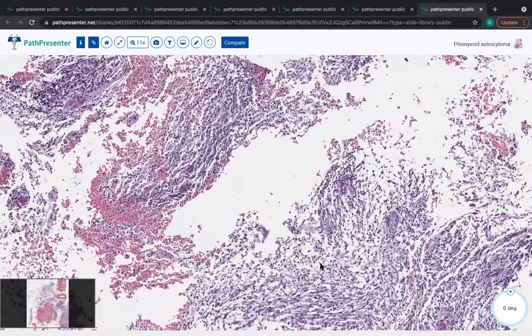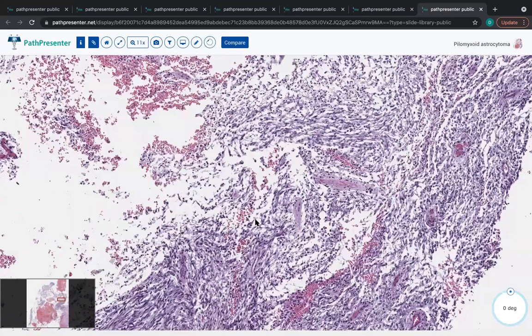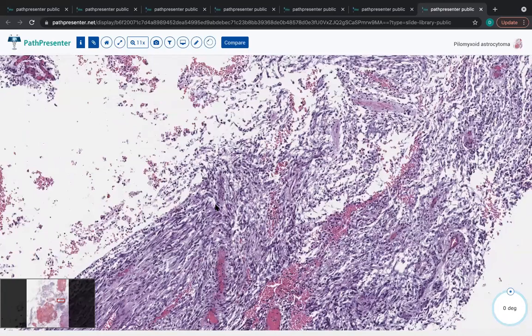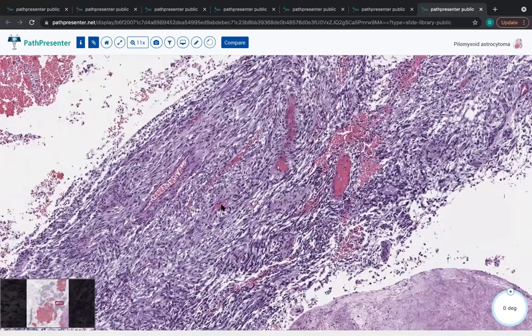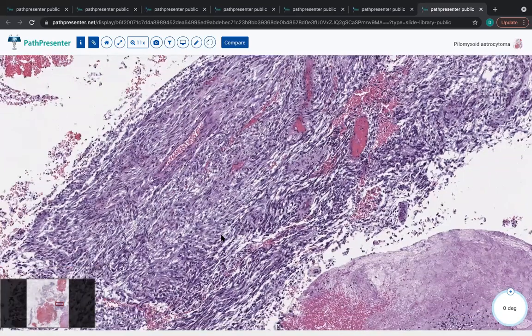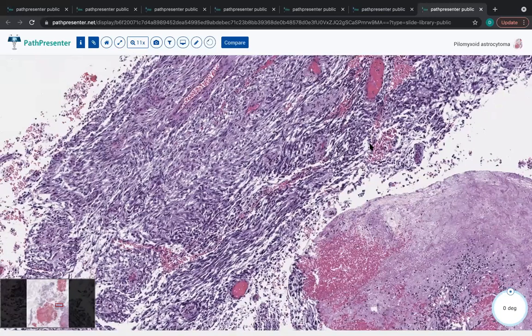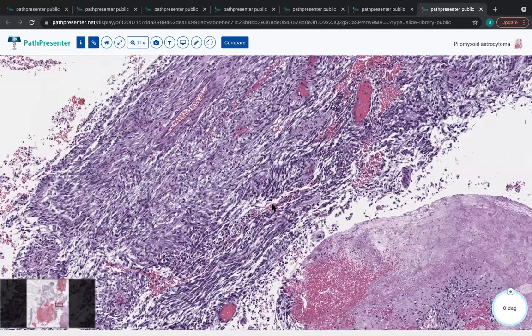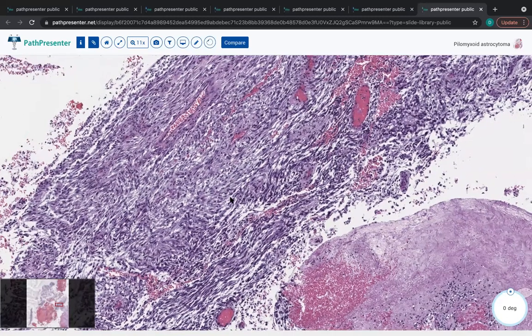So as a result, there may be a lot of descriptive diagnoses that we issue, but I think the more that we've learned through the molecular profiling of these tumors, we learn that they're actually a fairly heterogeneous group of tumors, and the natural history can vary dependent on the molecular driver. So, I don't want to call a tumor a pilocytic astrocytoma that may be more aggressive because it has a more aggressive molecular profile.